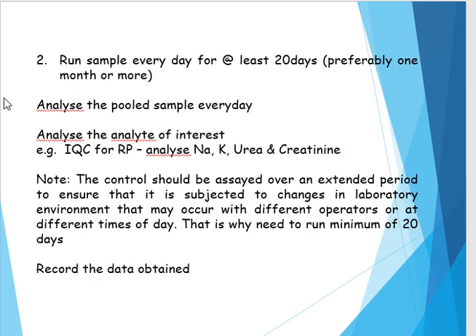Okay, and then we need to run this material every day for at least 20 days, preferably 1 month or more. So we need to analyze the pool sample every day. So we need to analyze the analyte of interest. Example, IQC for RP, of course we need to analyze sodium, potassium, urea and creatinine. Note, the control should be assessed over an extended period to ensure that it is subjected to changes in lab environment that may occur with different operators or at different times of day. That is why we need to run a minimum of 20 days.